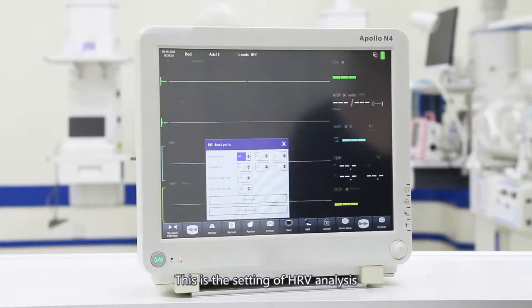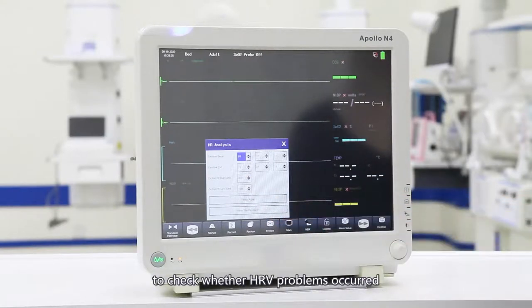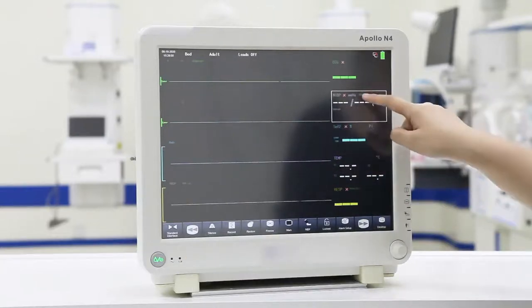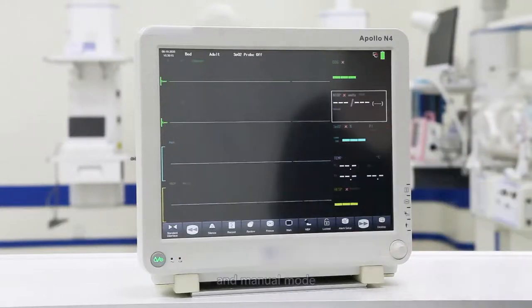This is the setting of HRV analysis to check whether HRV problems have occurred. Below is the blood pressure value. Click to enter the blood pressure setting interface. You can set the measurement mode. There are three modes: automatic mode, continuous measurement, and manual mode.